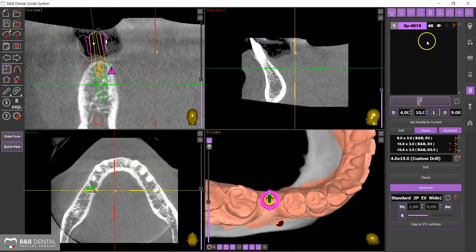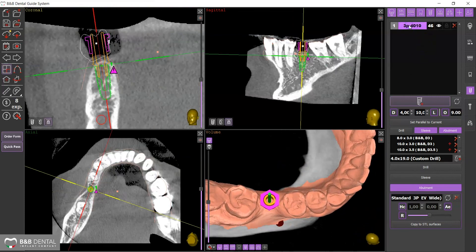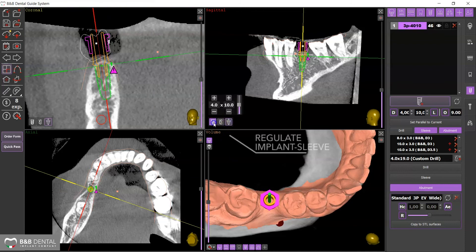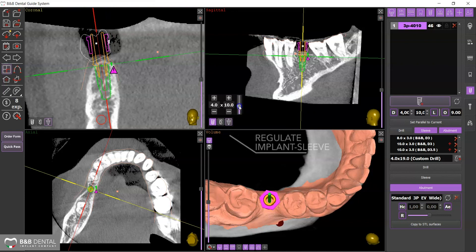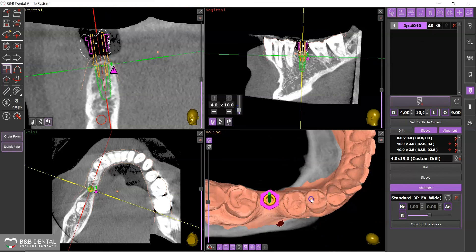By clicking on the implant in the upper right panel, you can view all the connected elements, such as sleeve and drills. Clicking on the icon in the display, you can rotate the implant and consequently the sleeve as well, with the use of various movement functions that can be activated.